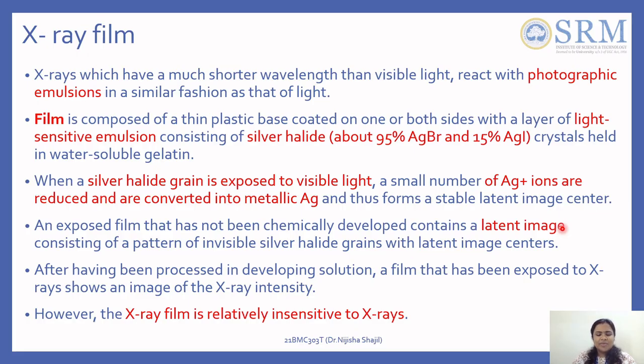So in that area, depending on how much the X-rays fall, if it is falling less, you will have it in white color. If it is totally fallen, it will become black. Just think of it as a silver white color film. You are allowing X-rays to fall on it. If X-rays totally fall on it, it becomes black. If it doesn't fall, it becomes white. When totally none falls, it becomes total white, like that.